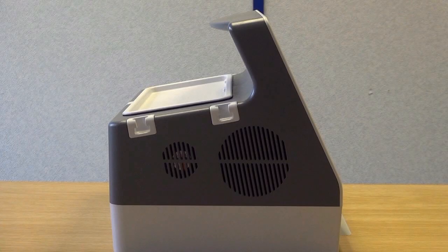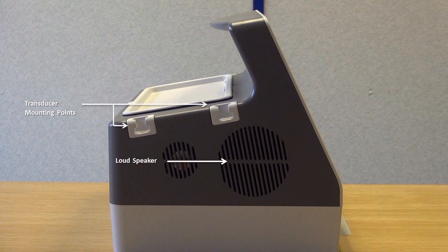The left side of the unit features a loudspeaker and two additional transducer mounting points.